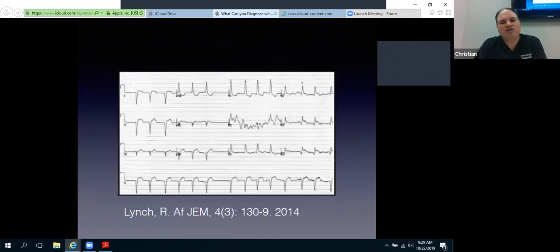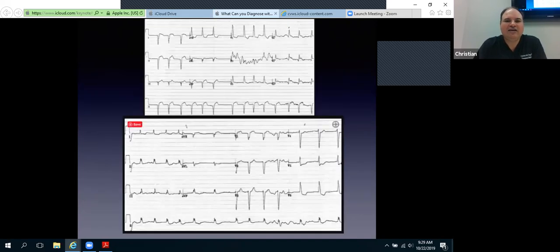So they see this, and then they compared the two, and he said, look at the differences here. Lead 1 is inverted, and lead 2 is inverted from what it should be. And then we kind of see the same thing for AVR, and AVF also is inverted here.